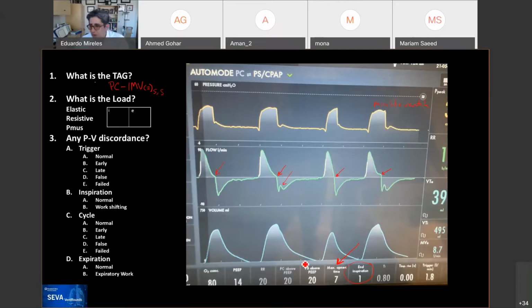And Rob could not be with us today, so we're having here a comment from Ariel, who has done this. It says, so you change from PCAC to Automode, PCPS, so from PC-CMV to PC-IMV. Automode has another combination too. Yes. The trigger timeout from 7 to 12 is the waiting period for a spontaneous breath to appear. If not, then they start sending mandatory ones. That's correct.